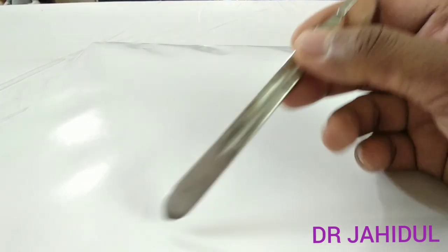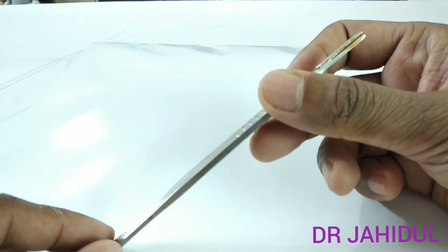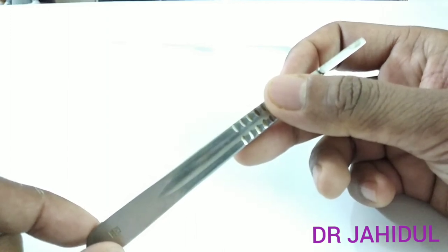Number 4 BP handle will be attached with surgical blade numbers 18, 20, 22, and 24.